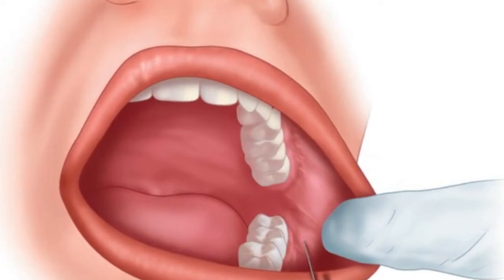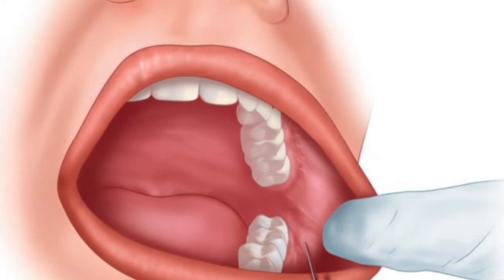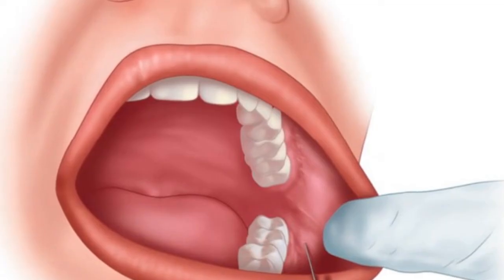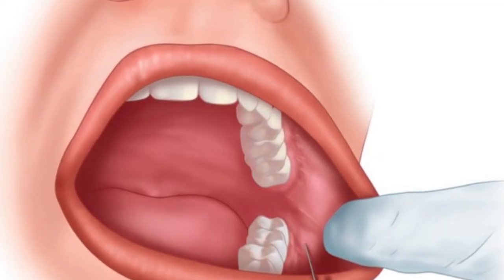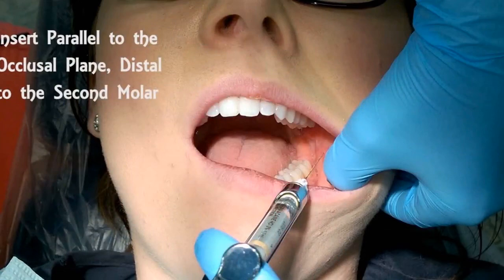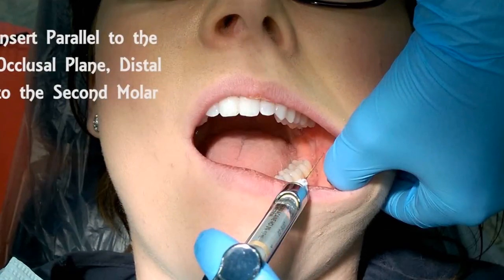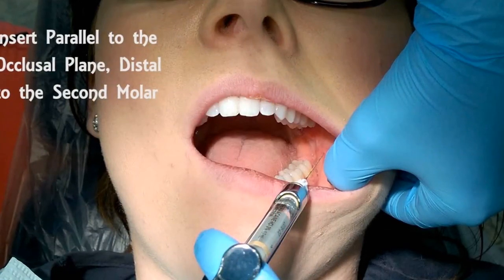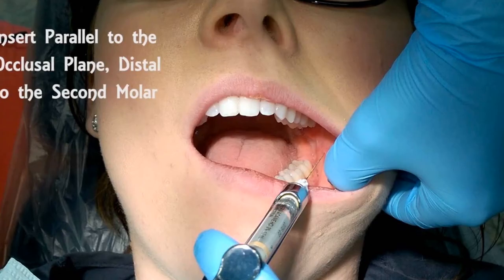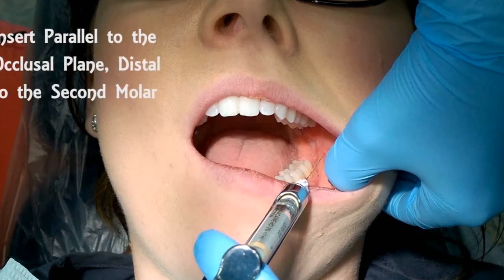Here is a clearer picture showing you coming parallel to the occlusal plane of the teeth. Here is another picture: insert the needle parallel to the occlusal plane at the distal buccal cusp of the last tooth.